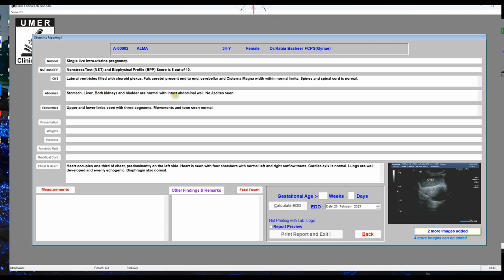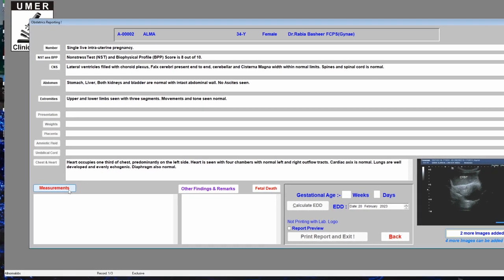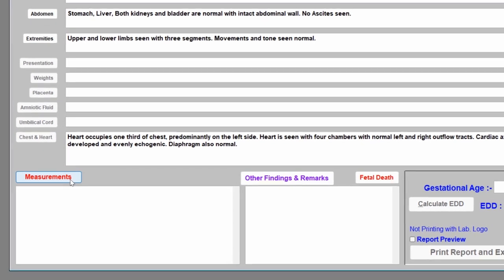Now come to the screen where you will edit the patient report. First is the number — how many fetuses — is it a single, twin, or triplet pregnancy? Then NST and BPP score, CNS of the fetus, abdomen of the fetus, and extremities of the fetus. Before editing any of these entries, first click 'Measurements', as this is a very important step.